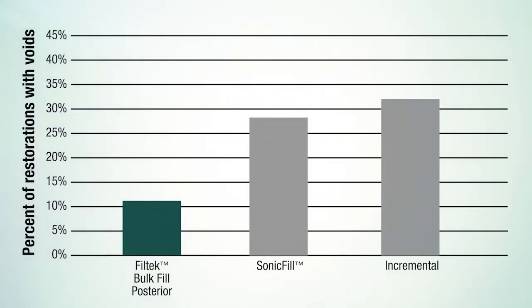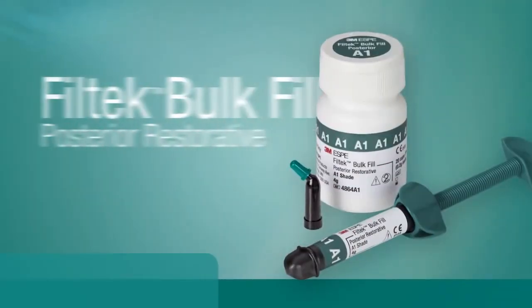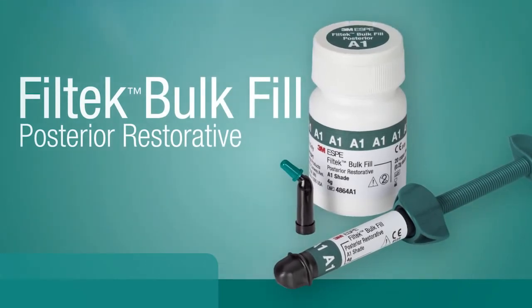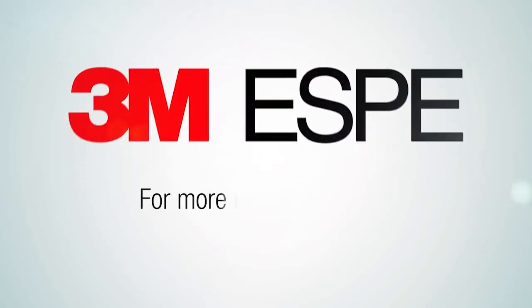With Fill-Tech Bulk Fill posterior restorative, as compared to the bulk fill composite SonicFill as well as an incrementally placed composite. Fill-Tech Bulk Fill posterior restorative — one increment up to five millimeters, one fast and easy solution. It's the one you've been waiting for, and it's only from 3M ESPE.